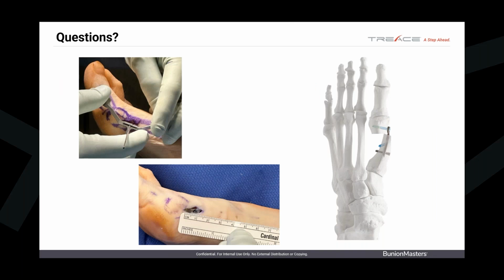Yeah, like I said, I'm an MIS surgeon. I want there to be MIS surgeons. I like the speed Aiken approach. The problem is there's an incision there that almost bridges those two incisions so close. At some point, the patient will think that they're just one. So I really encourage physicians to cut their teeth on the Aiken.